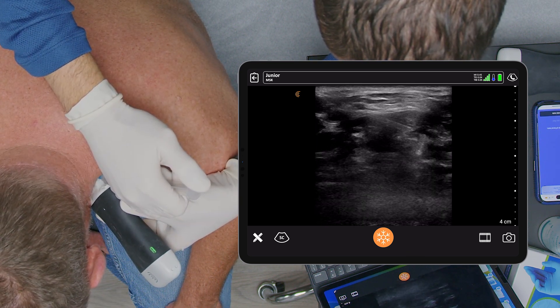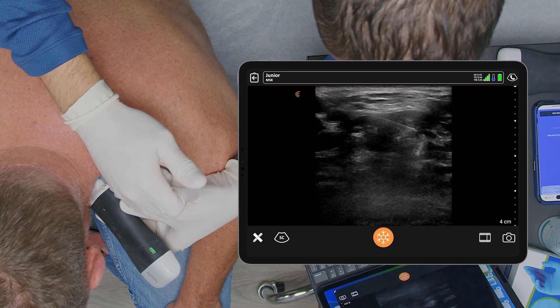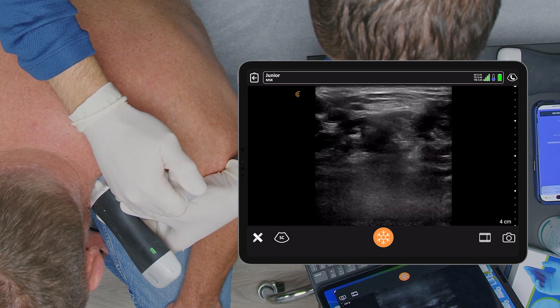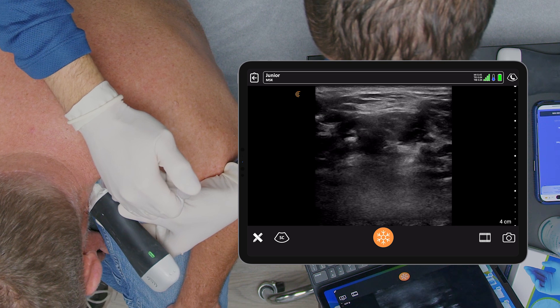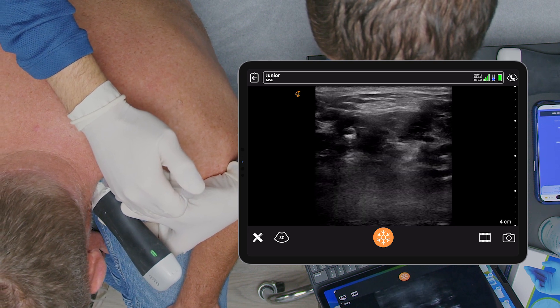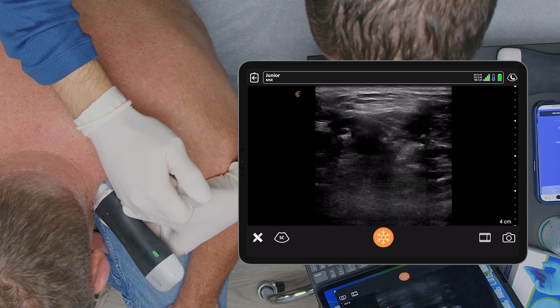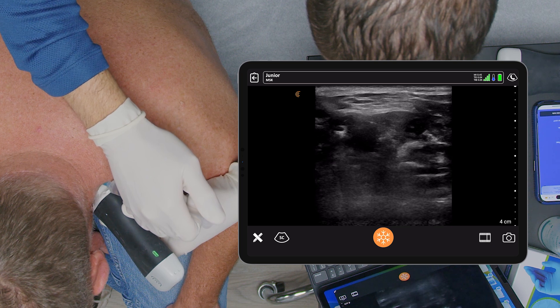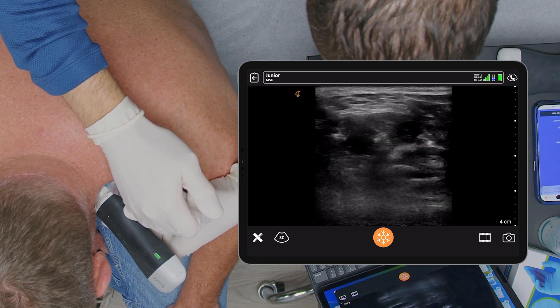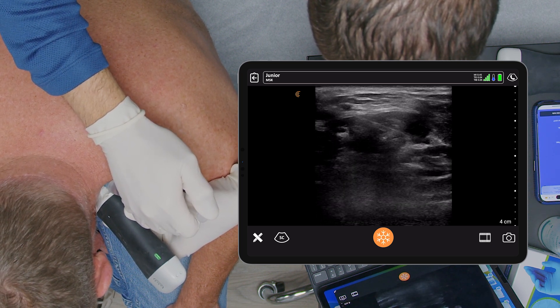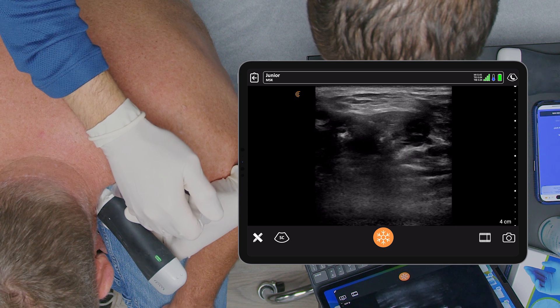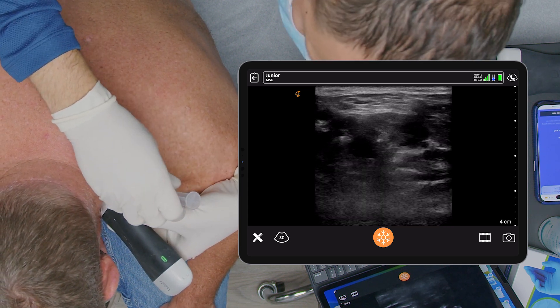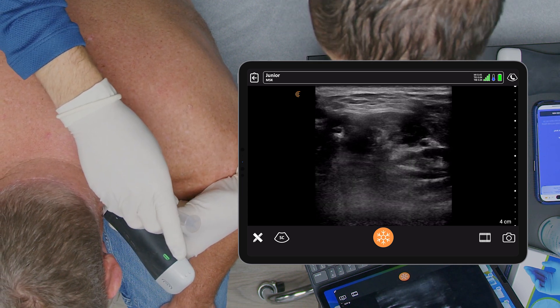Here's my needle coming near the C6 nerve. Anything shooting down your arm? The patient reported sensation going down his back rather than the arm, so I'm taking this needle back.